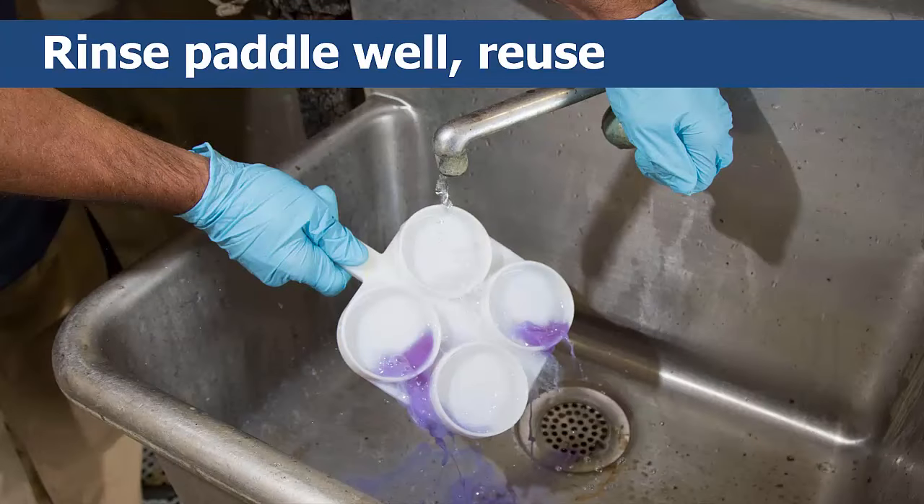After reading and interpreting the test, you can pour the mixture of milk and solution down the drain, then rinse and clean the paddle with disinfectant. You can then save and reuse it.